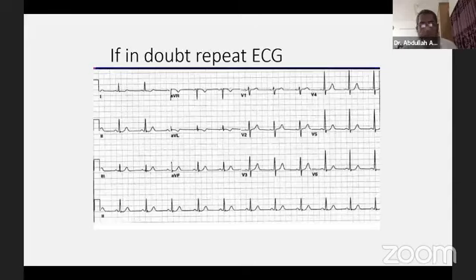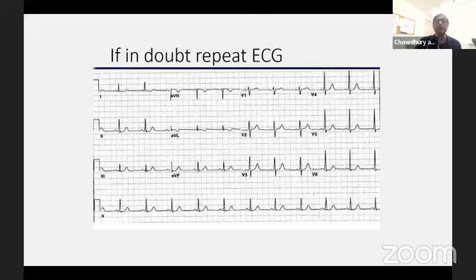Thank you. So here is another EKG, a patient coming with chest pain, not sure. Sometimes if the pain is severe, clinically looking like STEMI, then we don't need to pay too much attention to the EKG. However, I understand when you give some poisonous drug like thrombolytics, we need to be very careful about convincing ourselves that it is indeed a STEMI.